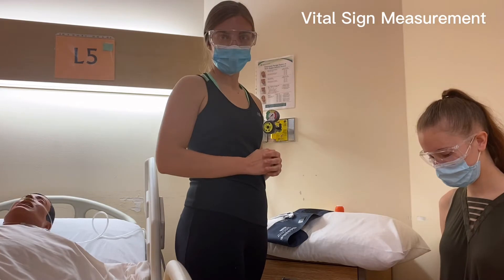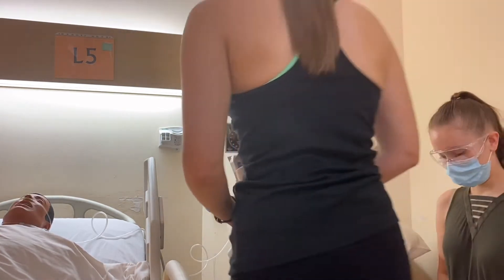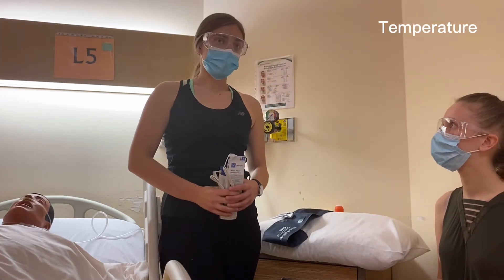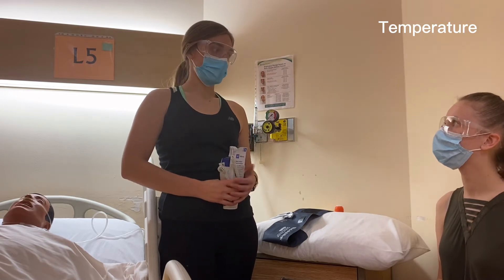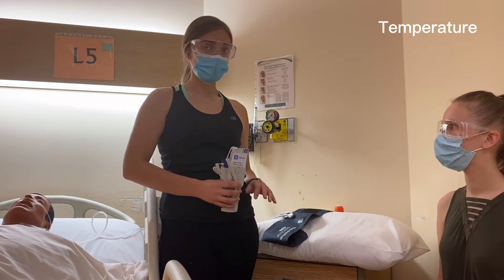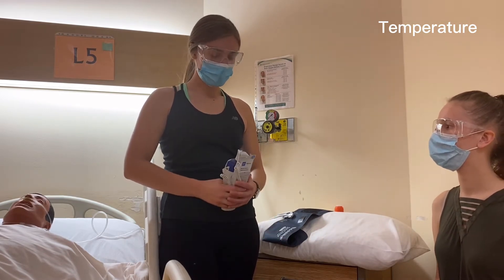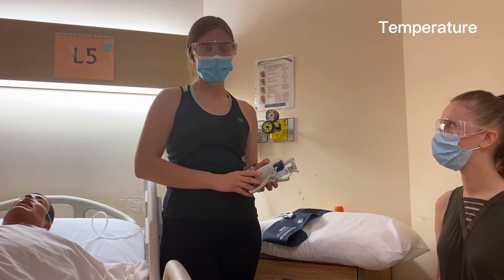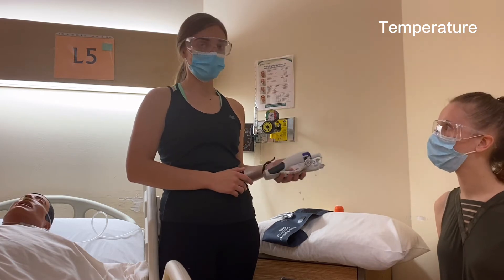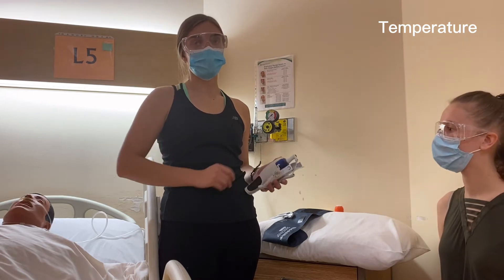We'll start with the patient's temperature. Before taking any vital signs, we want to ask the patient if it's okay to take their vital signs — ask their permission — and in this case it is okay. We're going to make sure they're sitting comfortably; right now we have her seated, her posture is up, her feet are on the ground. With taking temperature, we're going to take an oral temperature today. We ask the patient if she's had anything to eat, drink, or smoke recently. She hasn't, but if she has, we'd save the temperature to the end of the assessment.